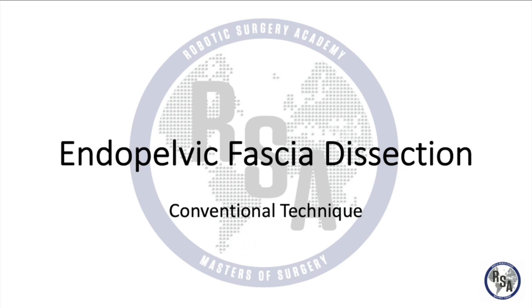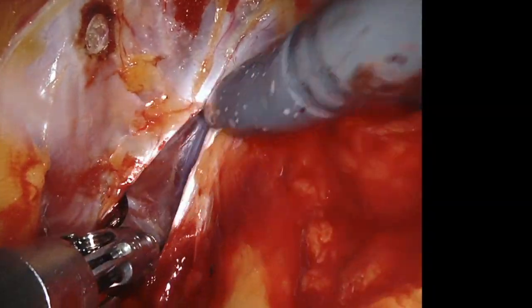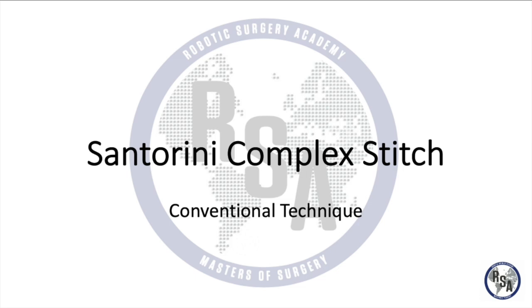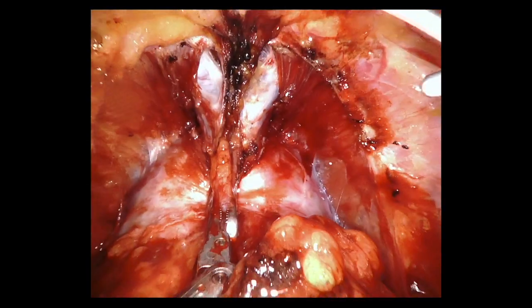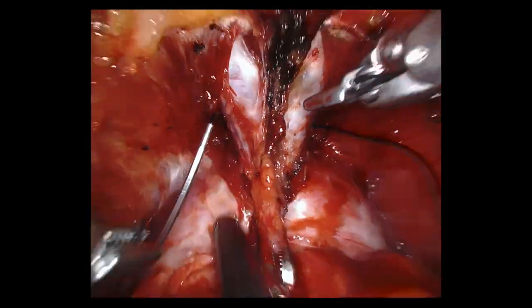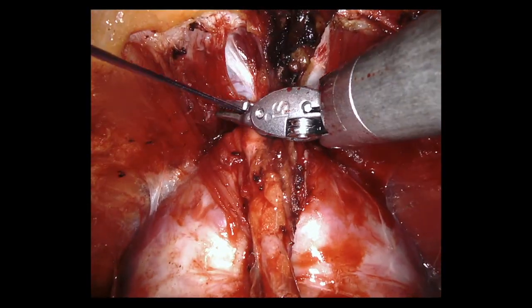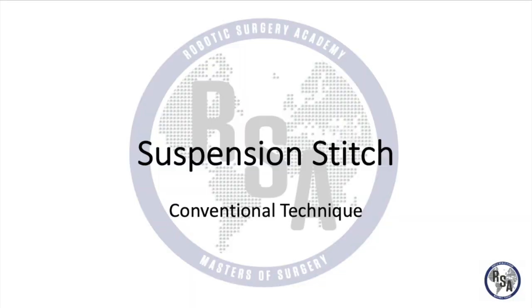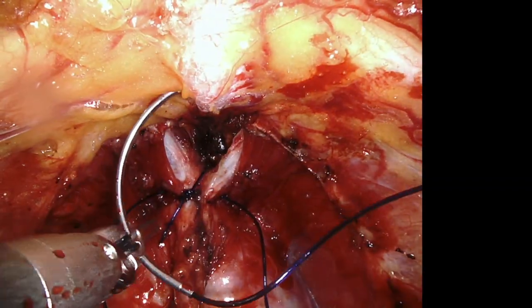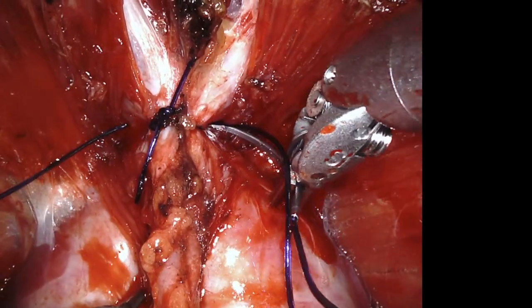In our conventional technique, we used to begin the procedure with the endopelvic fascia opening to assess the prostate apex and apply the DVC and suspension stitches. The Santorini complex stitch used to be performed after the endopelvic fascia opening and apical dissection. We used to apply the suspension stitch after the endopelvic fascia opening to replace the pubic prostatic ligaments divided during the apical dissection. This step is not performed in the current technique because the apical anatomy is preserved.